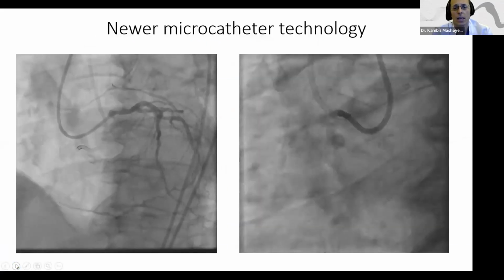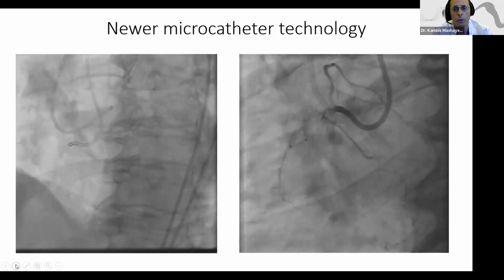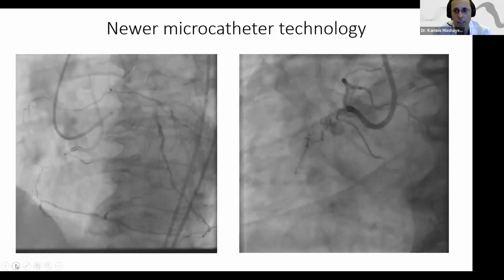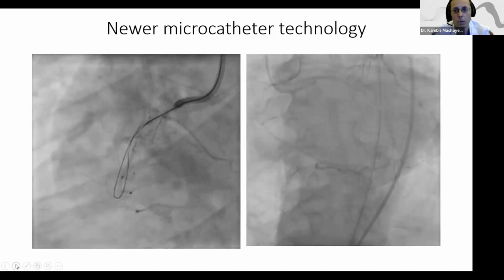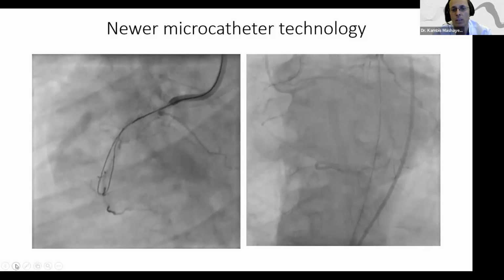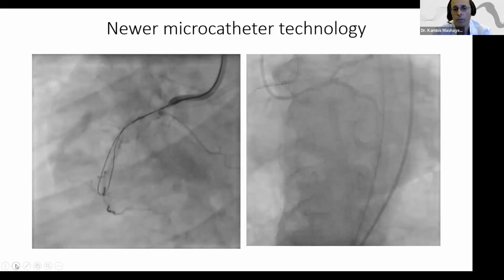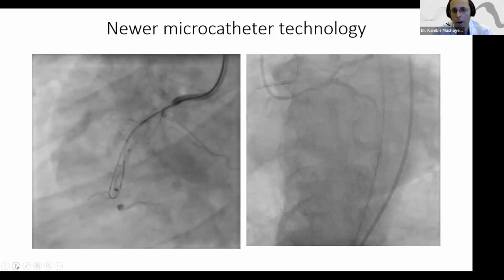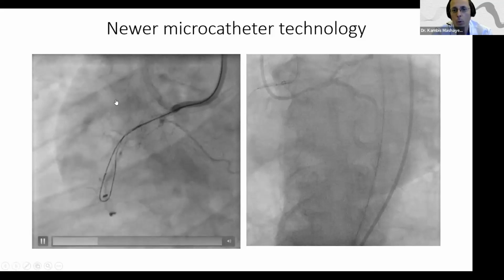And here you see it. First of all, for sure, I try to do a wire escalation, but what you will see after, let's say, 2 or 3 minutes, I was in subintimal, I just did a knuckle to prepare an antegrade cap, and I have the Corsair Pro XS.